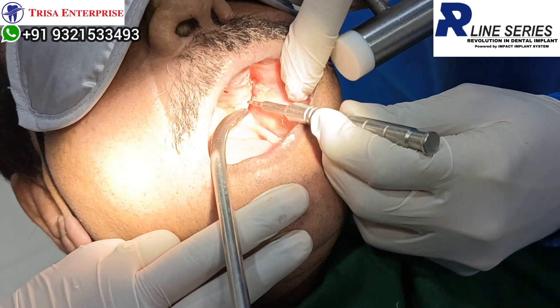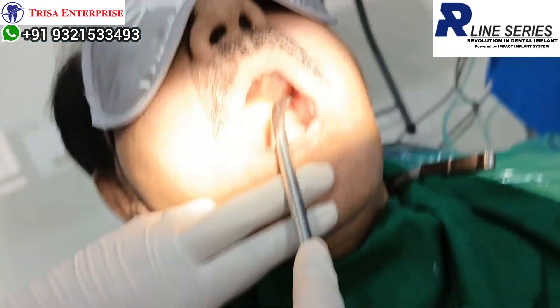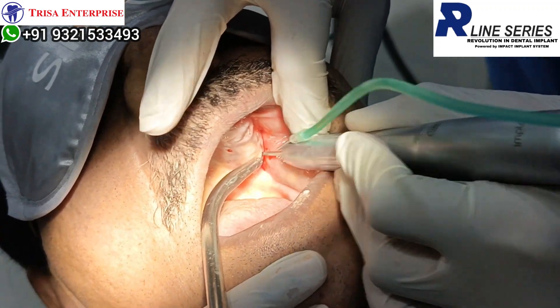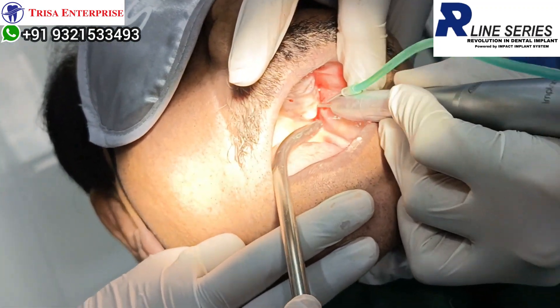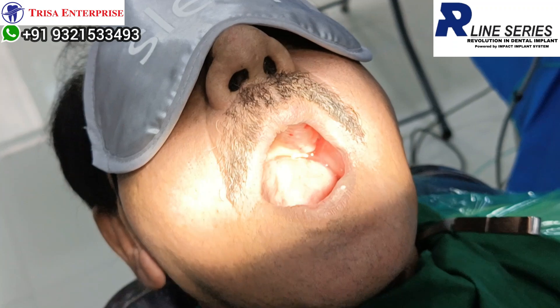My drilling protocol over here will be pilot drill and twist drill for my VCS MV implant. I am starting with my pilot drill. Already the drill is hitting the opposing cortical — all I need to do is perforate it. Just perforate it.